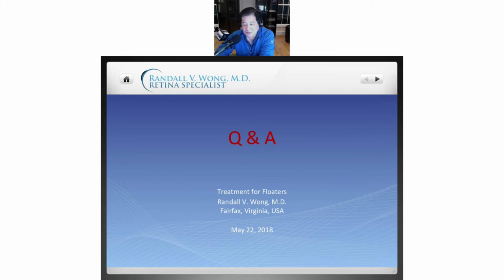Sarah says, quick question on the lasering. Doesn't that make burns on the retina? How does retina heal the burns and allow us to see? Well, again, you're not aware or cognizant of the area of the retina that we're treating. So there's actually no compromise to your vision.